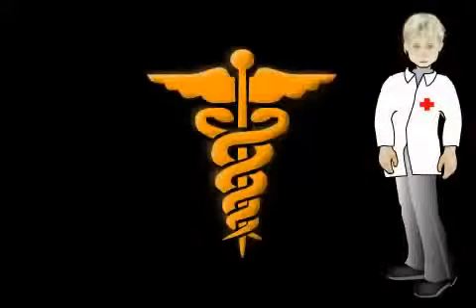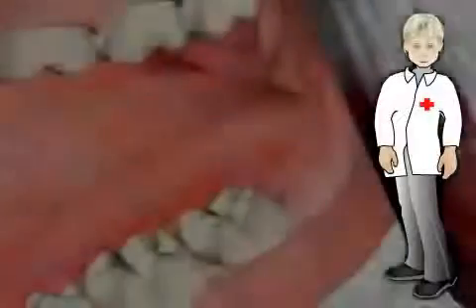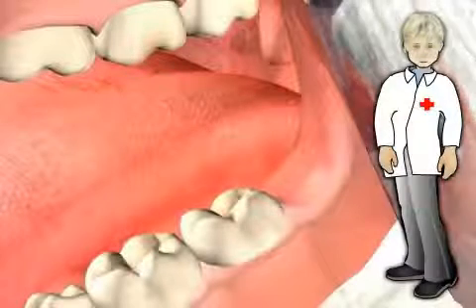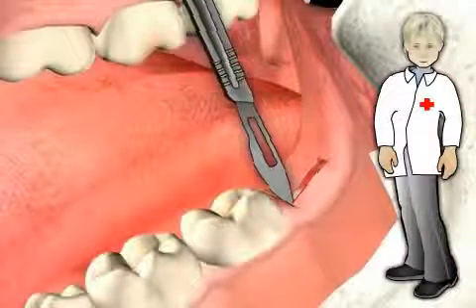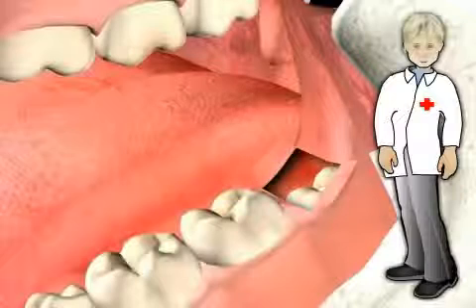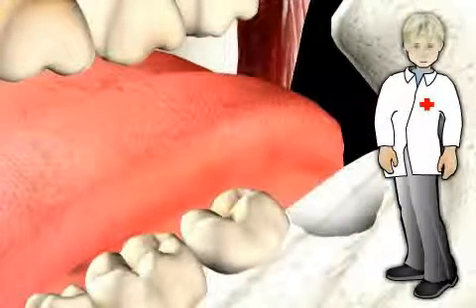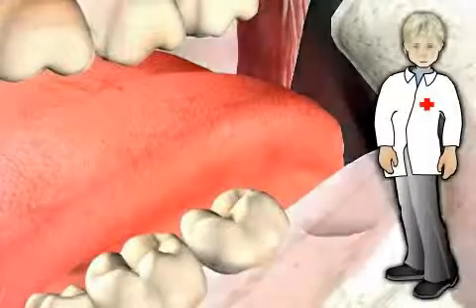We will spare you explanations of individual medical terms, such as retained, partially retained, or impacted, because the treatment consequence is always the same. Depending on the position of the particular wisdom tooth, the mucous membrane must sometimes be opened more, in effect moved to the side, and more or less bone must be removed.